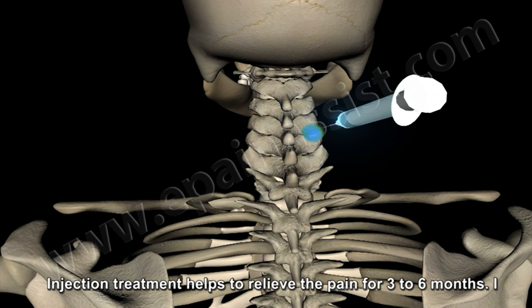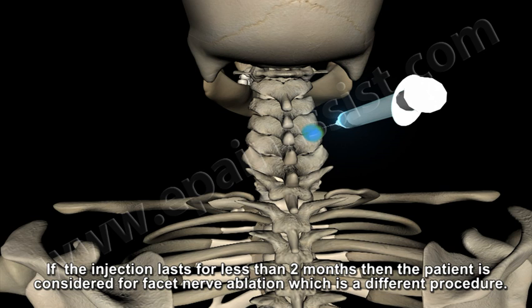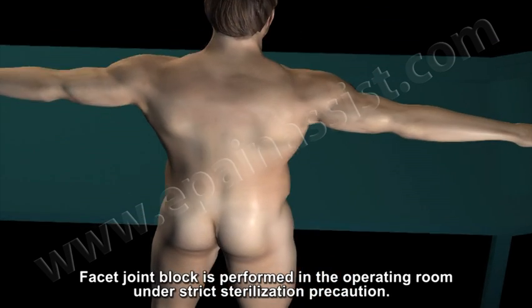Injection treatment helps to relieve the pain for 3 to 6 months. Injection is repeated after initial diagnostic injections every 2 to 4 months. If the injection lasts for less than 2 months, then the patient is considered for facet nerve ablation, which is a different procedure. Facet joint block is performed in the operating room under strict sterilization precautions.